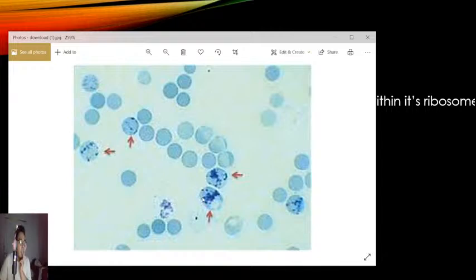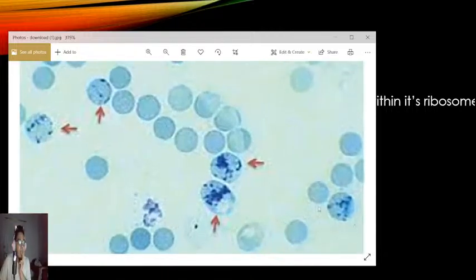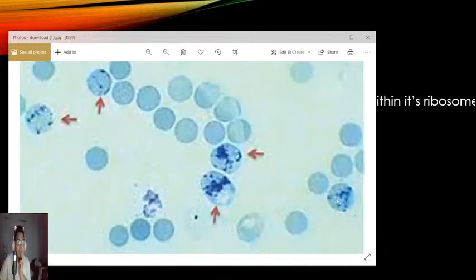So, sir, pag nag-count ako, same ba sila ng ika-count ko? Yes. Same lang sila. Basta anything where there's a lot of bluish peppers, I would call it peppered. Like, you know, when you buy a donut, there's like nuts on it. Those are the things that you need to count.